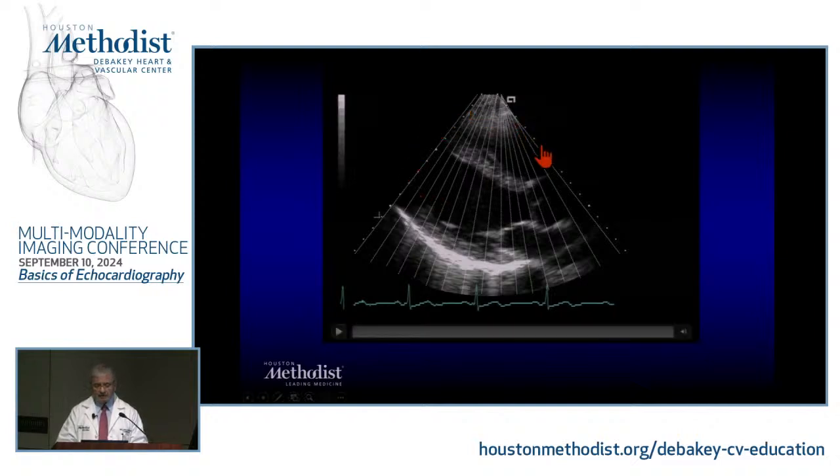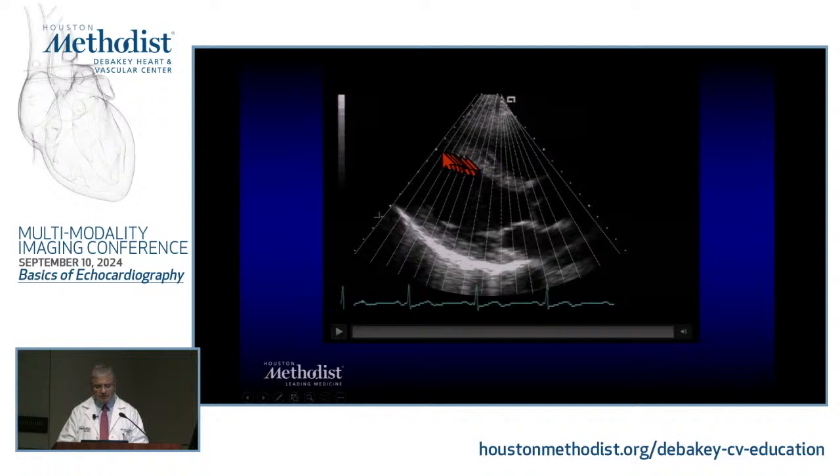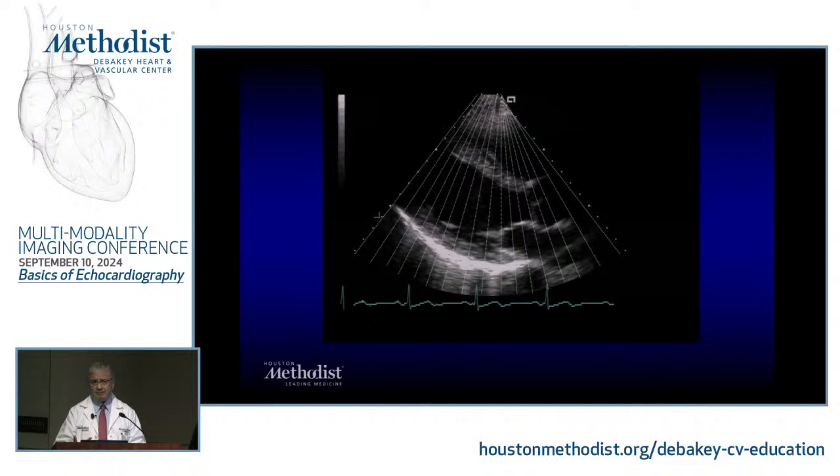So you can think of what's called line density. How many lines do you have? And you sweep through them, initially mechanically, but nowadays electronically. You sweep them from 1 all the way to almost 100 or so, 120 of these scan lines that you have. And it's done fast enough for you to see almost in real time. The frame rates are updated minimum 60, 70, and usually more than 100 per second, which is amazing, really. So it's really close to very real-time imaging of the structures.